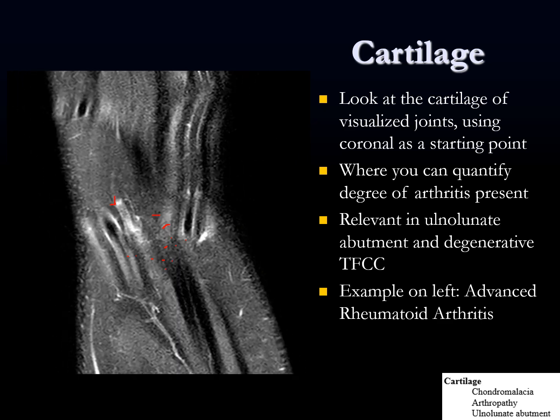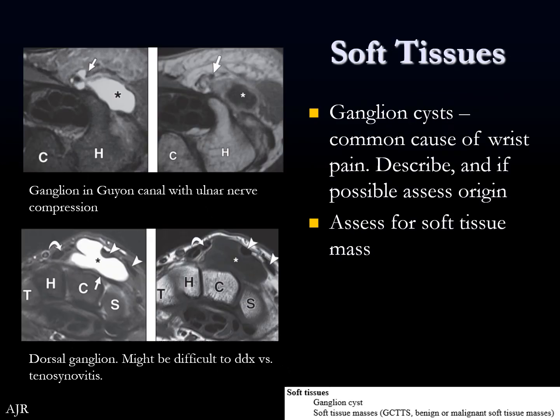Soft tissues — ganglion cysts are a common cause of wrist pain, so we're always looking for masses. I tend to do that towards the end, looking for soft tissue masses, especially ganglion cysts. If I see a ganglion cyst, I like to measure it, describe it, and if I can, say where it's coming from — because ganglion cysts typically have a communication with the joint space or other source. Here's an example of a ganglion in Guyon's canal with ulnar nerve compression, and here's an example of a dorsal ganglion.